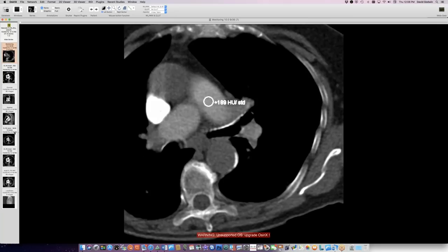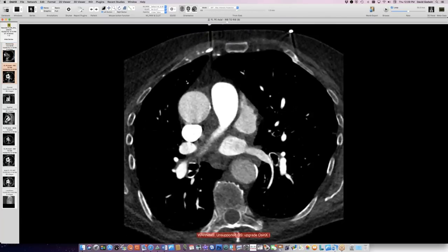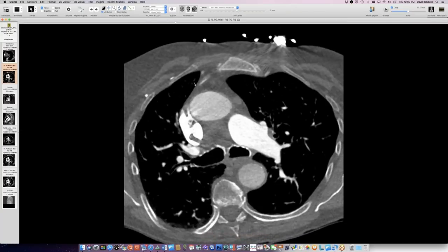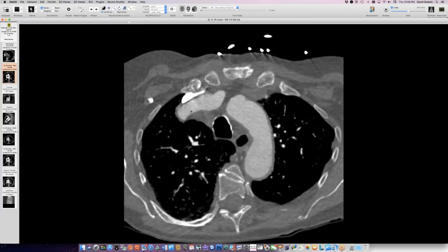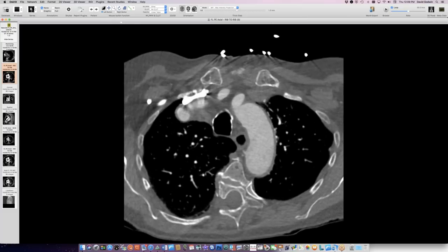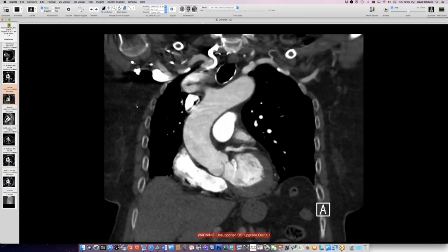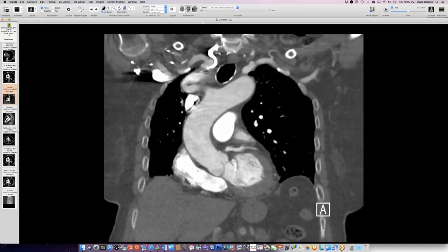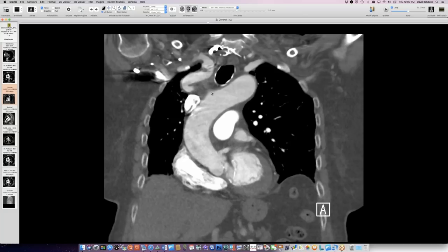She did have a CT scan. Let me show you what this turns out to be. I thought this was a lung mass. Way up here, you can see she's got this extremely tortuous right brachiocephalic artery, which is actually border-forming on the mediastinum. I have a coronal projection showing this extreme buckling of the right brachiocephalic artery. So what I thought was a lung lesion is a really exaggerated example of right brachiocephalic artery pseudotumor, which typically causes modest widening of the upper mediastinum above the level of the aortic arch.